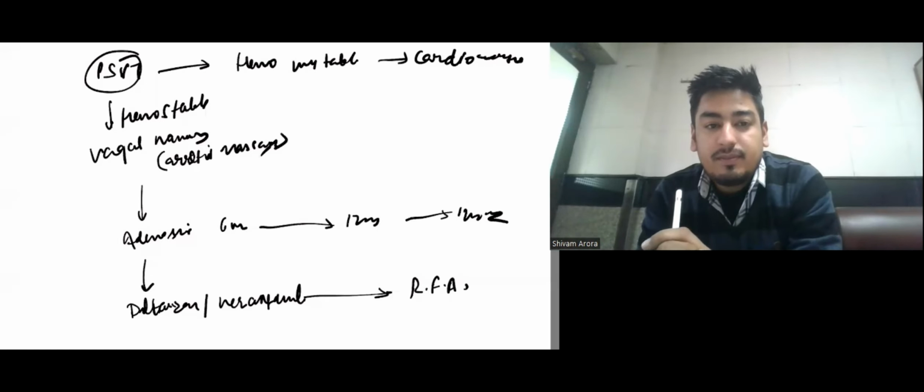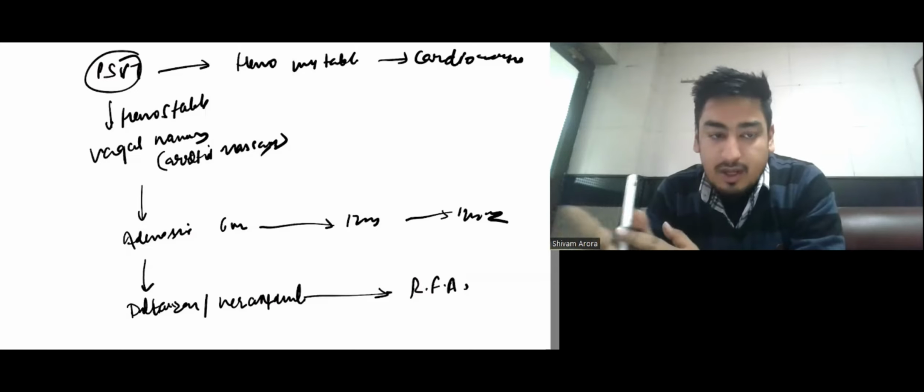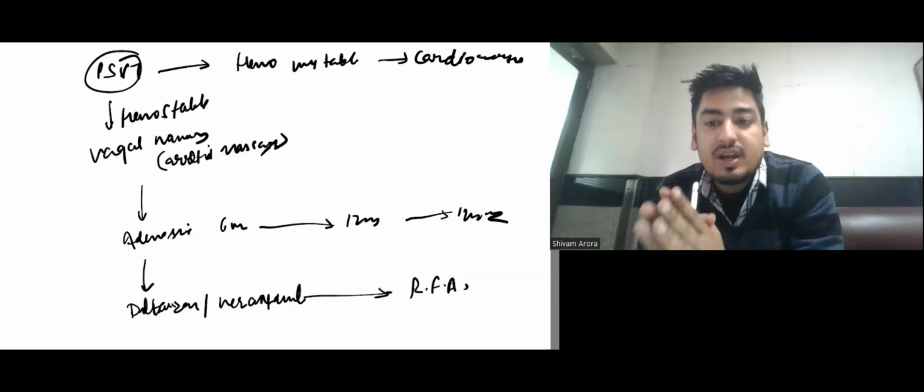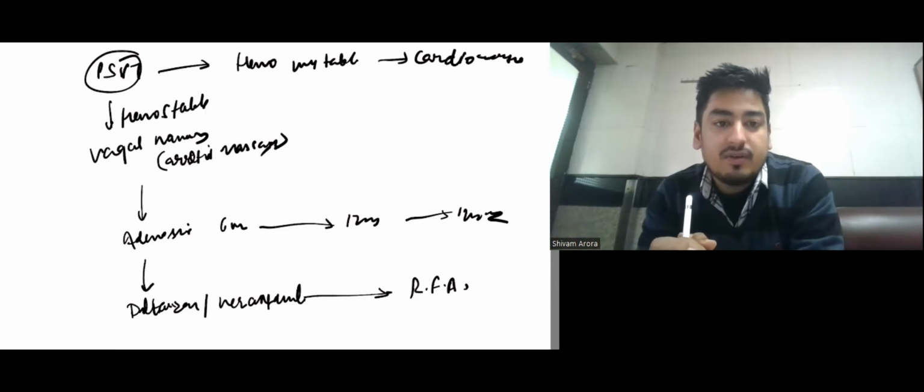So I covered all the important ECGs that have been asked till now and the ECGs that have the probability of being asked. So just try to understand them, try to grasp them, and you will definitely solve all the ECG questions in the exam. Okay, all the best.